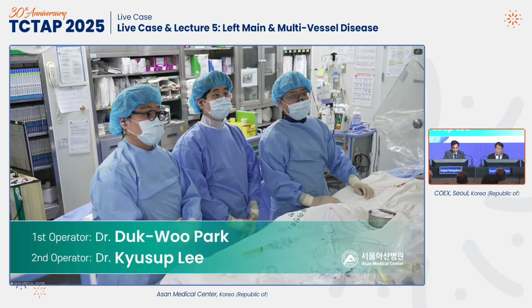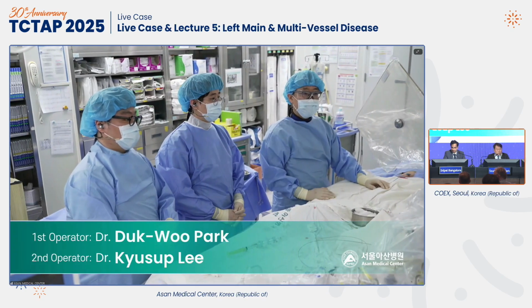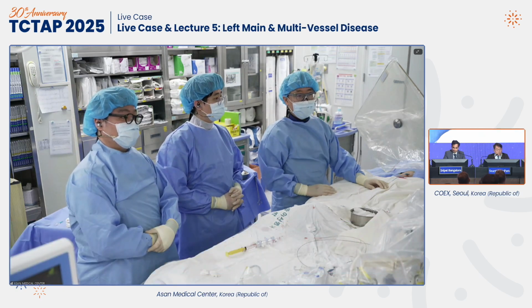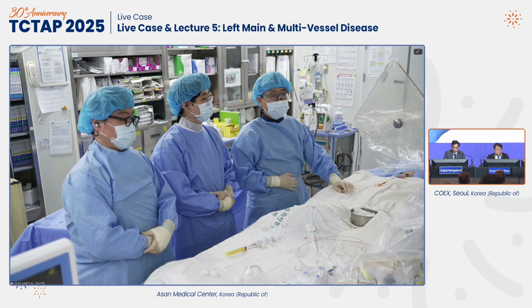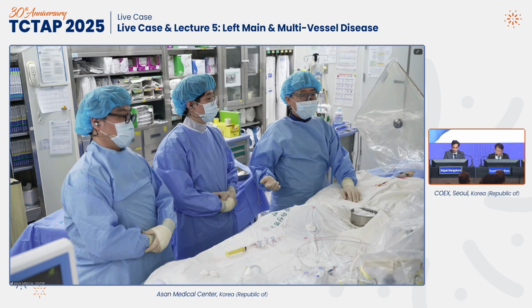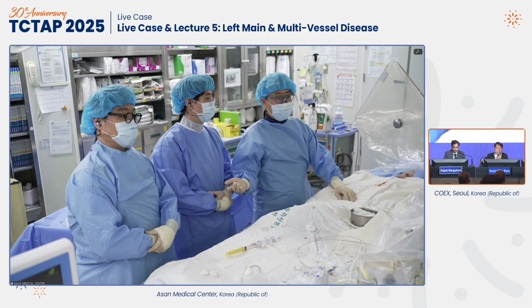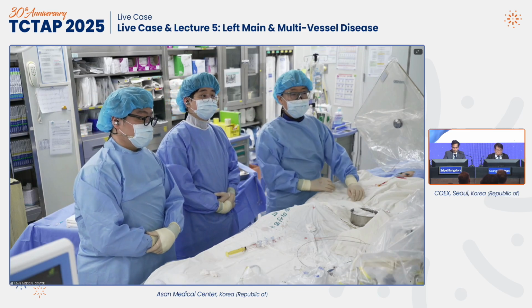Thank you for joining our live case demonstration. This is another very interesting left main PCI, and we will have a lot of points to discuss. Before starting the live case demo, I will introduce our team. I'm D.W. Park from Asan Medical Center, and Kyusup Lee is a professor at Daejeon Seung-Mo Hospital. He is our alumnus, and Seung-Jung Lee, our senior fellow. Okay, Dr. Lee, can you present the patient background?